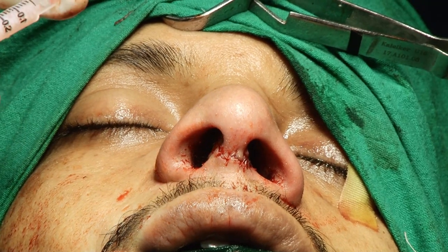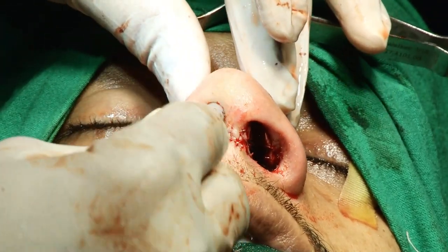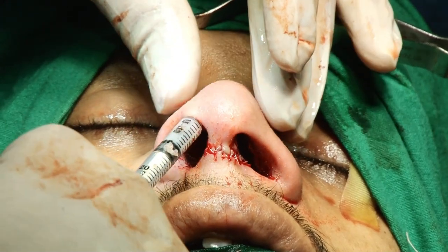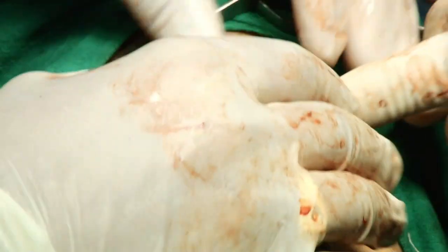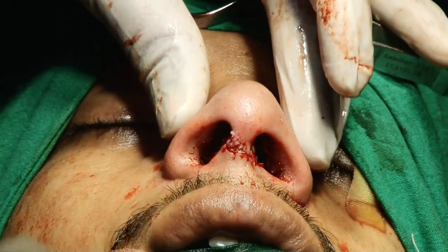Yes. Can we have the profile here, please? Yeah, I'll show you. Where do you inject exactly, sir? Yeah, this is the diced cartilage. Where do you inject? On the entire dorsum, just a little bit for better quality. Not structural, just for the refinement.